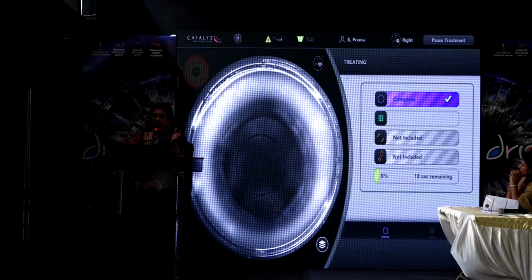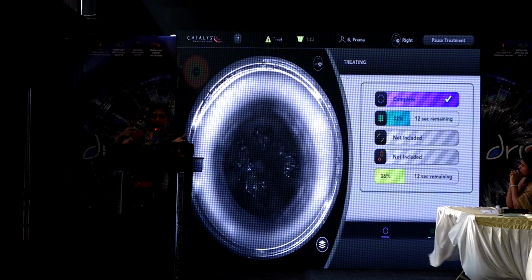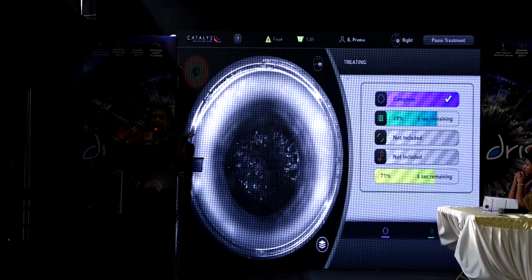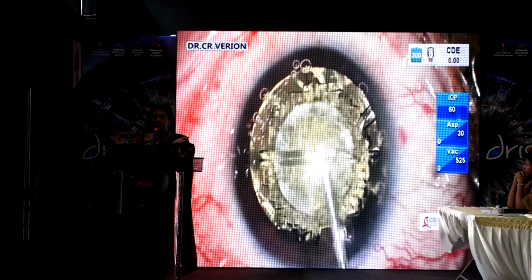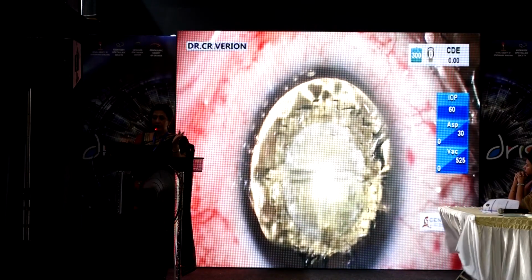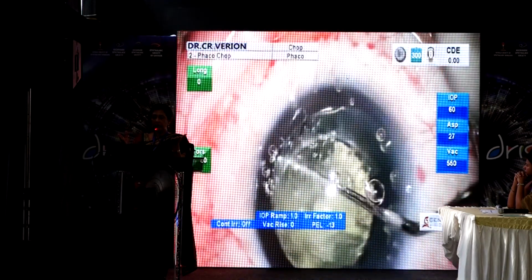And this was a case of RK, but there were not multiple RK incisions, thankfully. But these are all hypertrophic scars, and you could be clear that in these areas the rhexis might not get cut completely. That is one challenge which you have. If you have multiple RK incisions, it mandates that you make your incision more scleral than corneal. But as there were fewer incisions, the incisions were made between the two RK incisions, and you need to remember that these RK incisions could give way at any point of time.